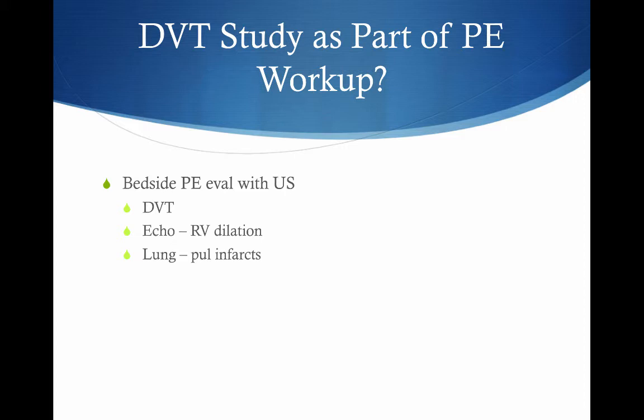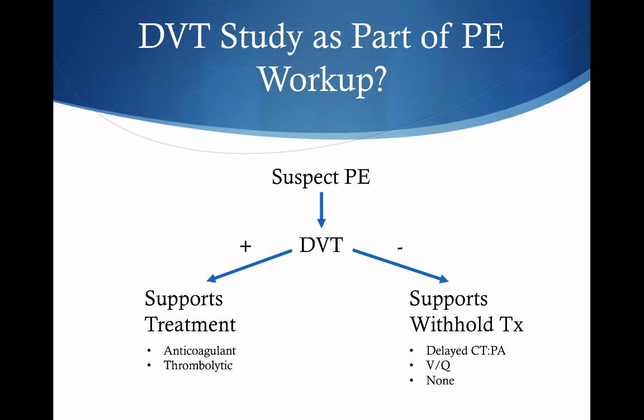It's been shown that doing this multi-system study with ultrasound to look for PE can be pretty accurate, but this is beyond what we want to talk about today, so we're just going to drop those out. Overall, this is a complex topic. There's lots of things to consider, so we're going to try to make it simple and stick with our focus on DVT, which is our real goal today.